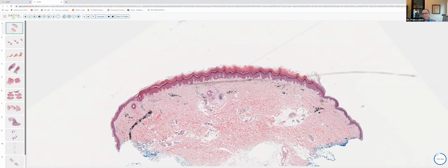And the accumulations of the material tend to vary not only in size, but also in shape. And typically with the older products, you don't get any host immune response. With some of the newer cross-linked hyaluronic acid products, they can be a little bit more immunogenic, and so you're more likely to see a little bit of granulomatous inflammation. And of course, this is resorptive material.